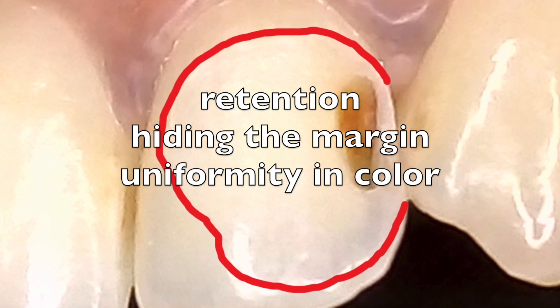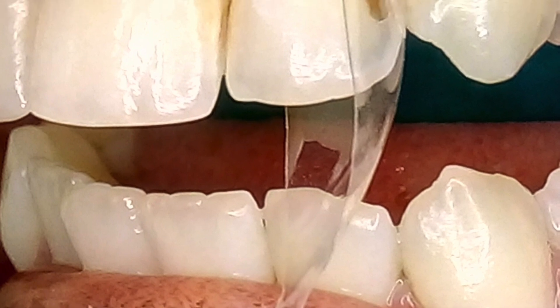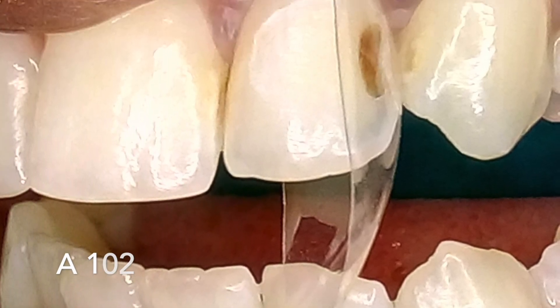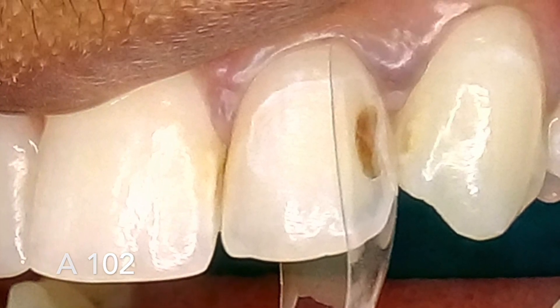After completing the cavity preparation, I inserted a bio clear anterior distal surface matrix, number A102. Notice how the contour is achieved and the matrix sits snug within the free gingival margin.